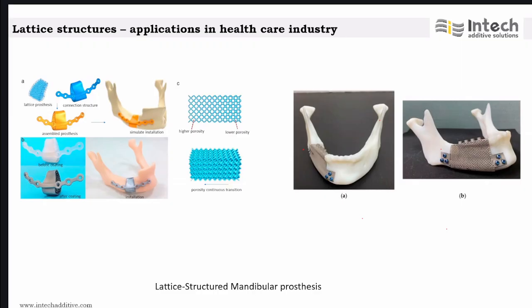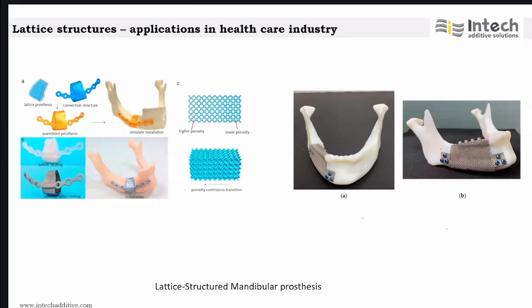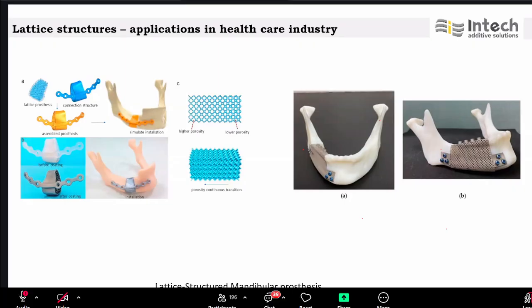These are titanium implants, which is done for mandibular reconstructions. Actually, these implants are too stiff. They exhibited a modulus value of 110 GPa, whereas bone normally is from 3 to 9 GPa. So in this case it's too stiff, and this latticing helps to relax those stiffness so that it won't take too much of load.